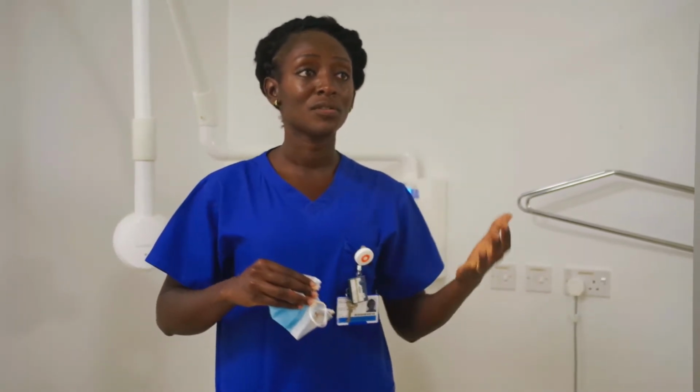Also, to ensure that you are getting consistently good radiographs each time, you'd have to carry out something we call audits. So you have to carry out an audit, not just on the radiographs that you've taken, but also on the equipment that you're using, to make sure that consistently they are giving you what you require to produce the best quality images.